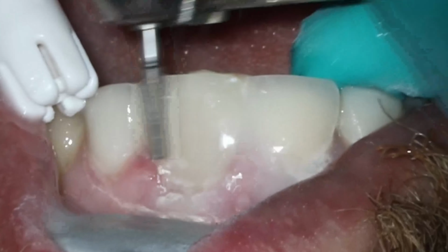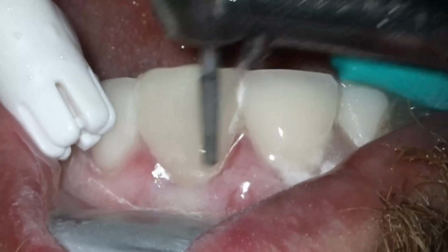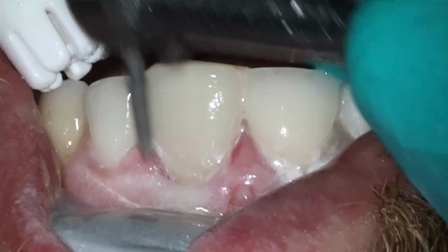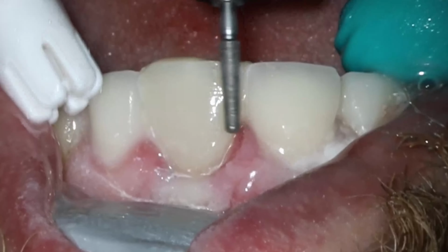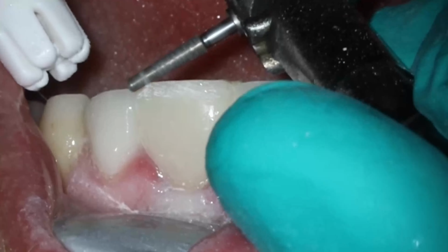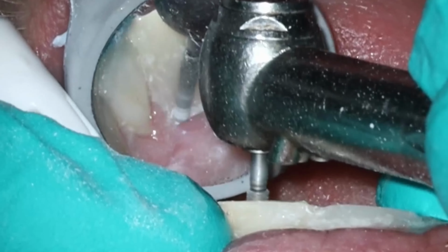So for a quick and dirty, hey, we just need to get a crown on here, or get him a tooth. I mean, the poor guy walked in with no tooth whatsoever, and now he's walking out with at least a tooth there. Even if the shade's slightly off, this is still a much better and very cheap way to do it. I didn't have to use any matrix bands.